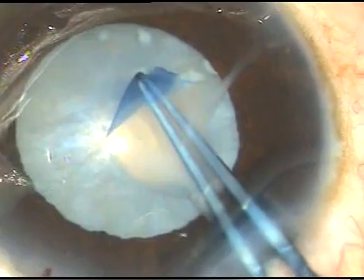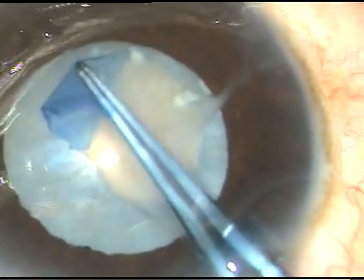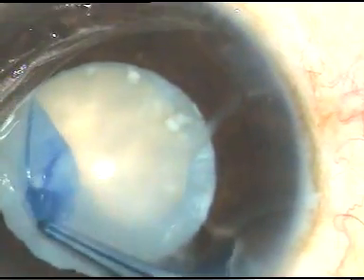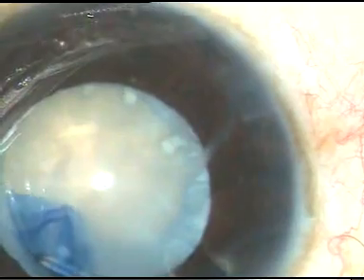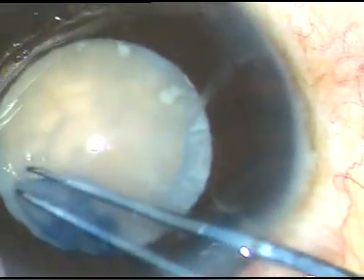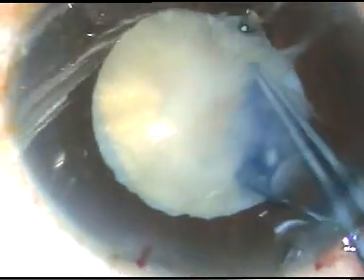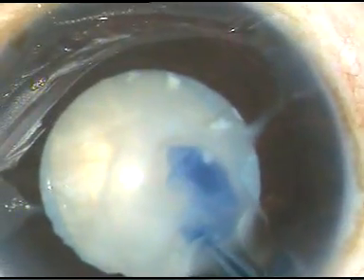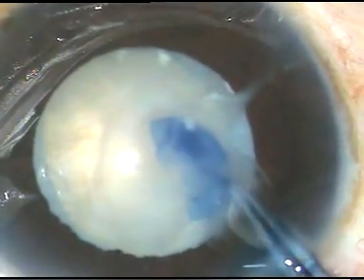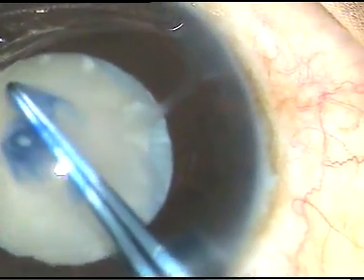Now, I expressed some viscoelastic substance. Along with that, milky fluid also got displaced and I could do the rhexis. The CCC is in progress at this moment, and here I complete the rhexis. The rhexis size is adequate.